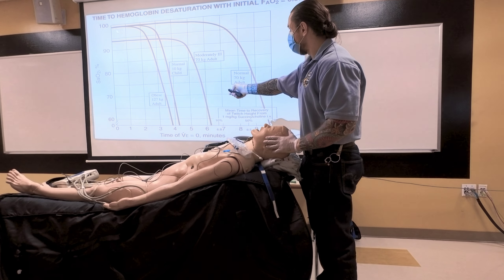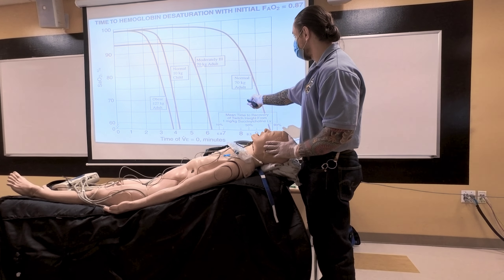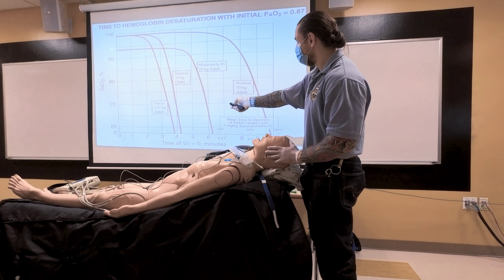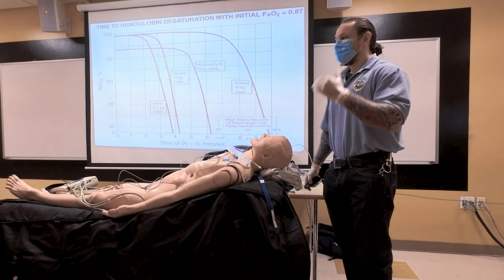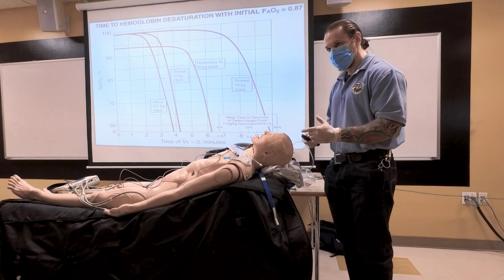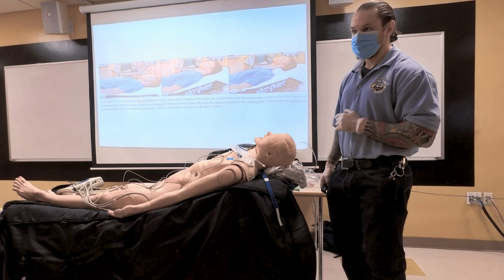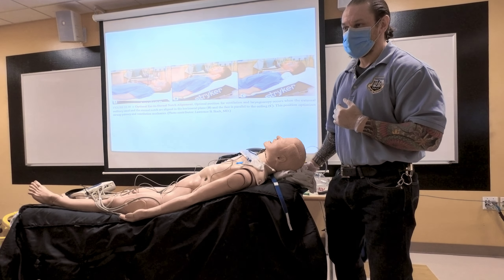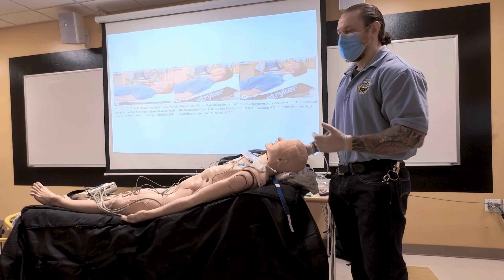This graph shows a relatively long period of slow decline, then a brief period of sharp decline — we want to avoid that at all costs. For the skill, you're going to get 30 seconds to intubate per the skill sheet. However, if I pre-oxygenate them well for three minutes — room air is 21% oxygen, 78-79% nitrogen — if I do complete nitrogen washout, I have 100% oxygen. A normal healthy 70 kg person has about 8 minutes from 100 to 90%. A sick 70 kg person has about 5 minutes, and an obese person almost 3 minutes. So if you pre-oxygenate well in the field, it's not like you have to rush. Pre-oxygenate well, spend your time diligently. For the skill though, it's going to be 30 seconds.